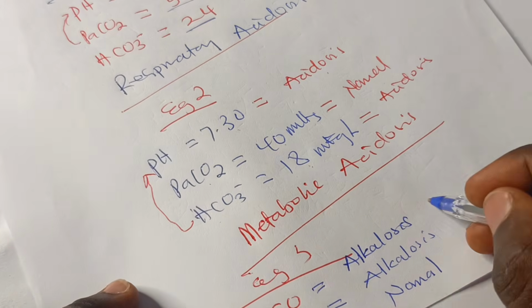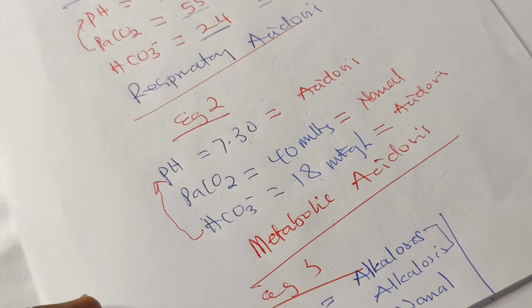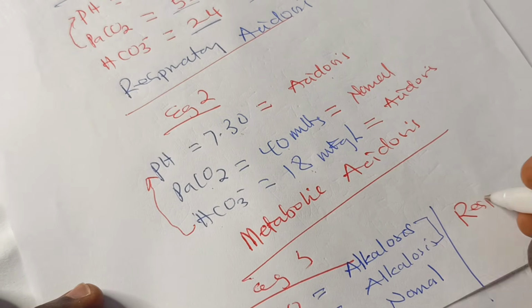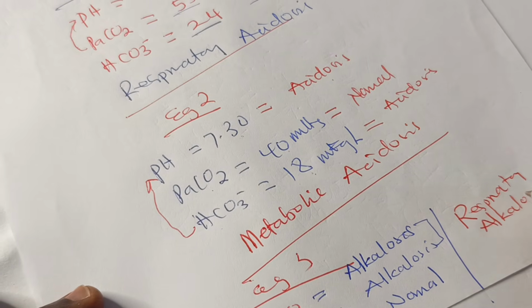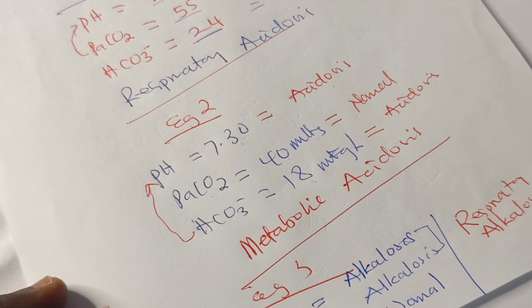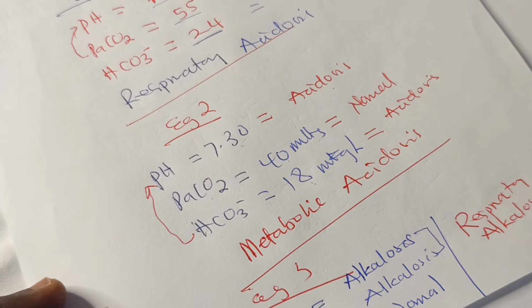Okay. Hence, what's your interpretation? This and this agree. So what's your interpretation? It is respiratory alkalosis. Great. Simple. Don't complicate it. Don't complicate it at all. I can see you are enjoying the example.